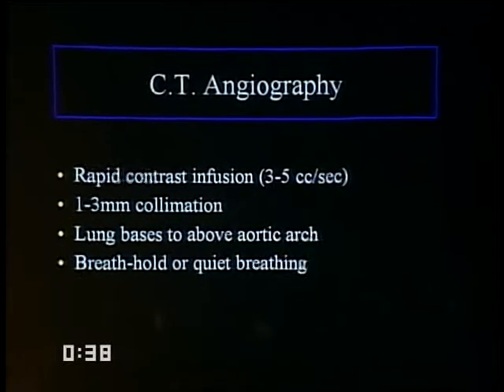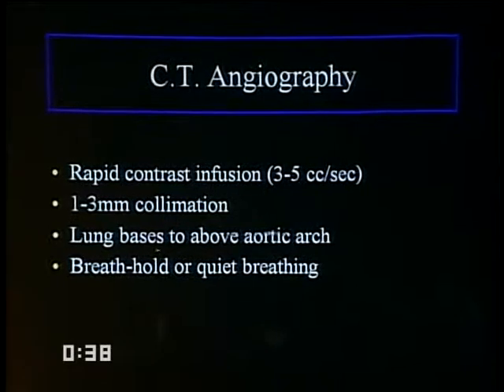Again, the technique that we use for CT involves as thin collimation as is practically feasible with the scanner that you're using. So on multi-detector, use 1 millimeter. On a single row detector, use in the order of 2.5. Still can be very diagnostic.